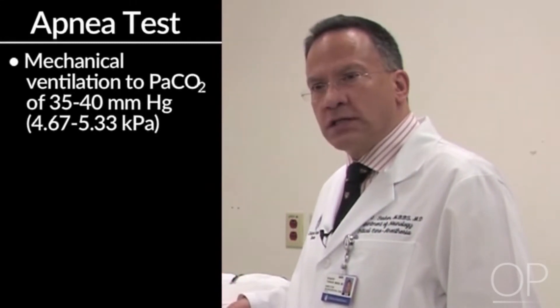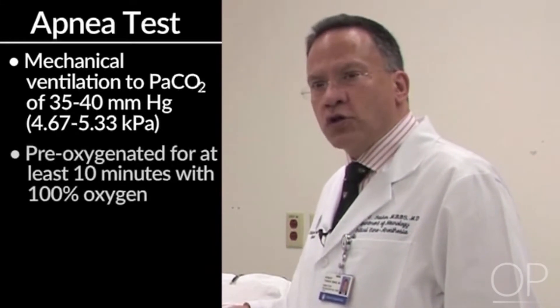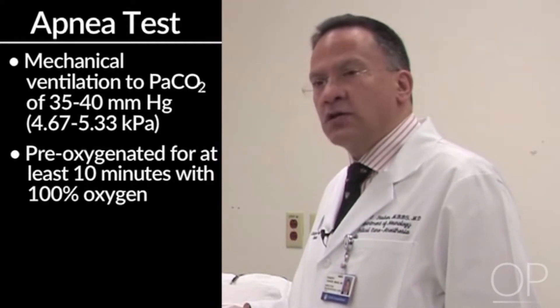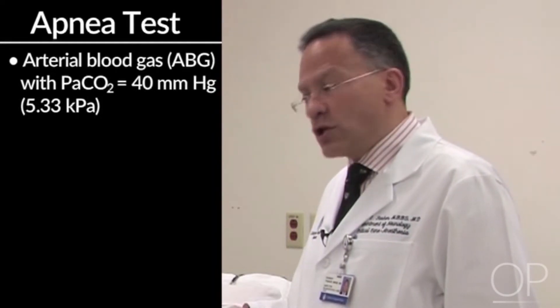Under normal circumstances, the child would have had their mechanical ventilation altered so the carbon dioxide was at around 40 mmHg, and we would have pre-oxygenated for at least 10 minutes with 100% oxygen via the ventilator, and have a blood gas to show that our carbon dioxide was around 40 mmHg.